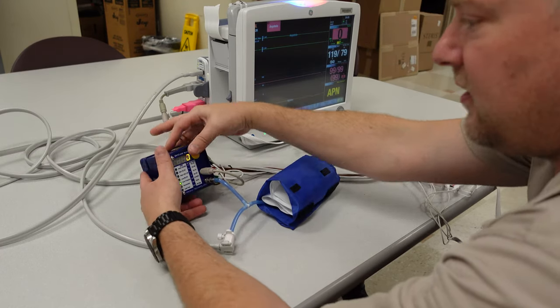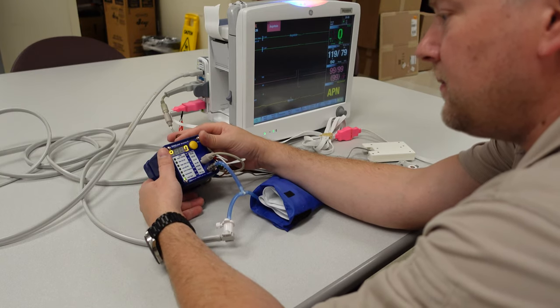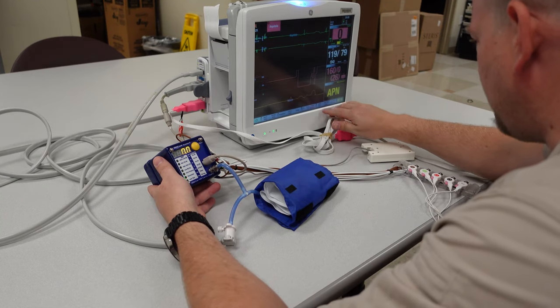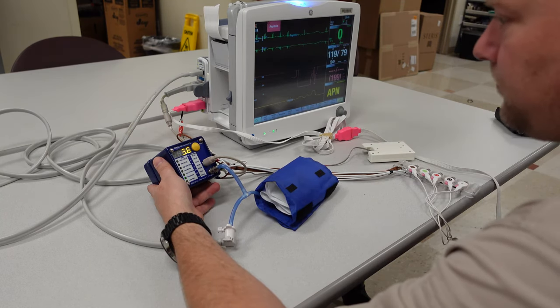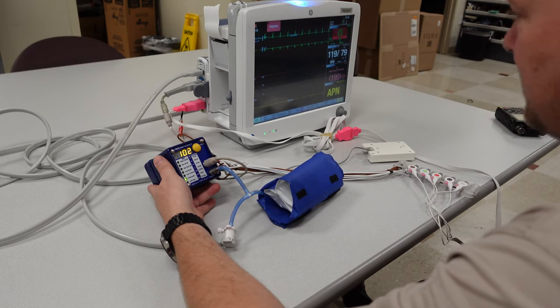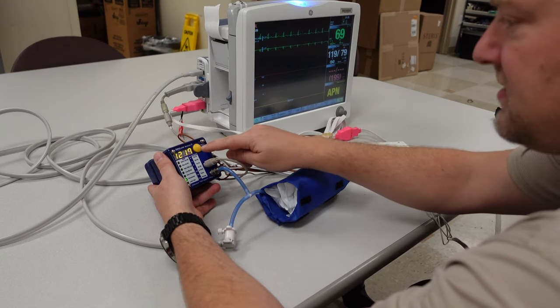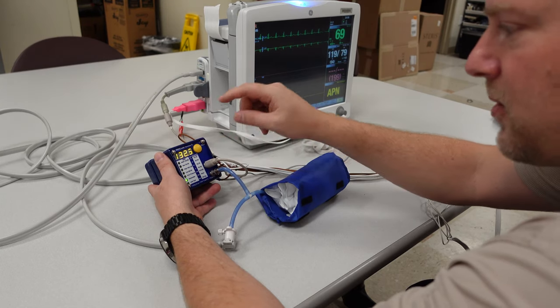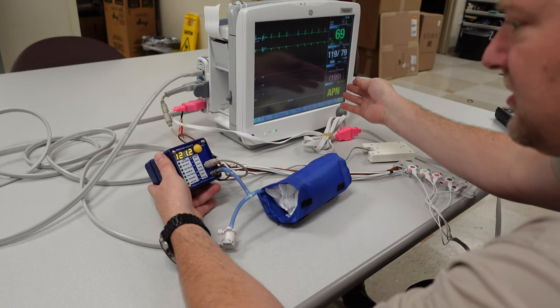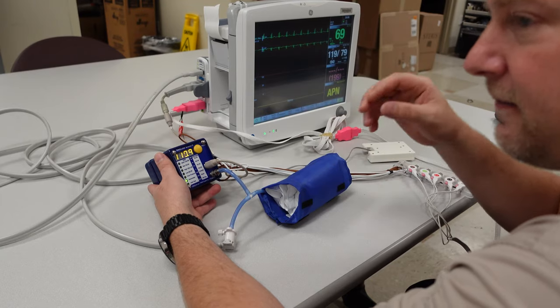There are other features on this device like overpressure, manometer, and leak test. The manometer is the one I really like. I'll put NIBP start - when I think my NIBP system has a leak, one of the things I like to do is watch the pressure on the screen as it goes up on my SimCube. Right now it says 130, and I should see 130 on my display. I utilize the manometer quite often for troubleshooting.